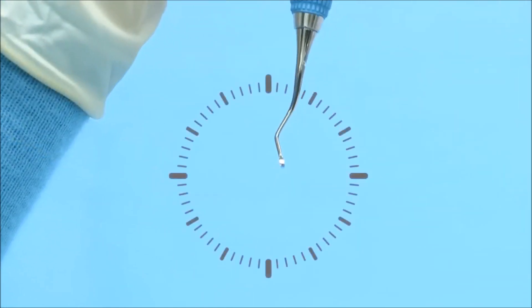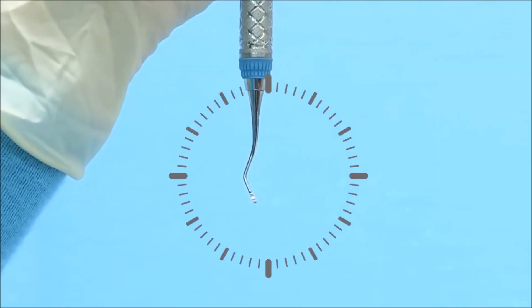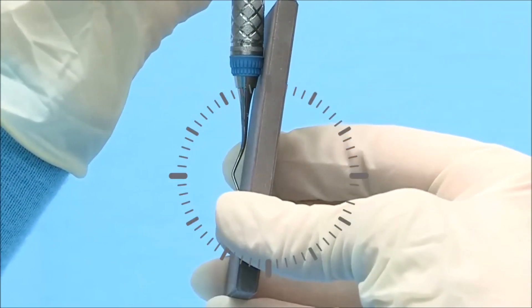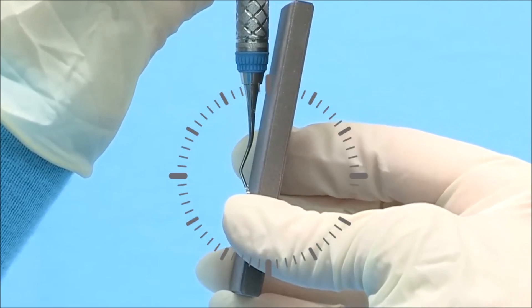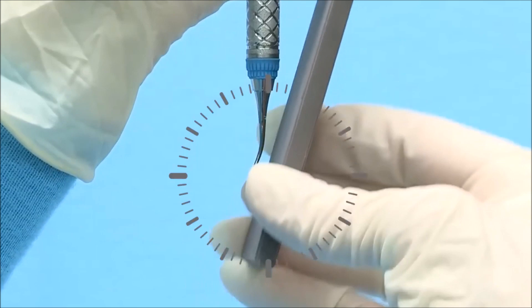Tilt the terminal shank slightly to 3 minutes before 12 o'clock. Position the stone against the right lateral surface at 12 o'clock and tilt the top of the stone to approximately 3 minutes past 12 o'clock.